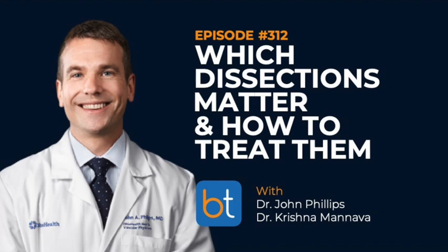So just be aware that they're expensive. If you're going to do them for the first time, try a couple of simple dissections, get a feel for it. Don't be putting 15, 20 of these things in, because that's not going to help anybody. But use them judiciously and you'll be all right.